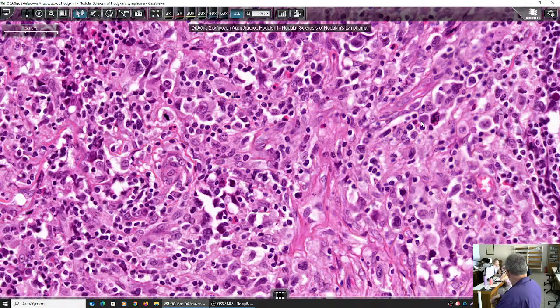I'm not sure about this one. Has this something to do with plasmacytes? Check it up. It's CD15 and CD30. All right? And despite that it is a lymphoma, CD45, which is the common leukocyte antigen, is paradoxically negative.